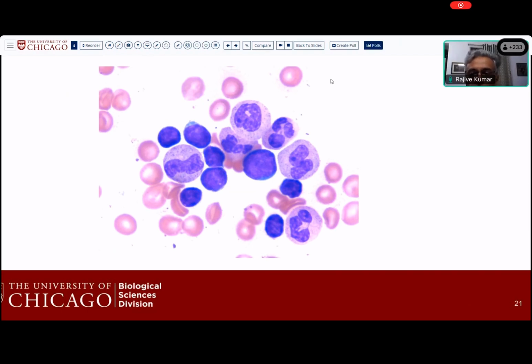After 2 months, the child, who was not on any treatment, celebrated his birthday. There was nothing wrong with the child. So what I'm trying to say is that by noticing this feature of transitioning, without any major change in the chromatin or cytoplasm, there is some change of course, but not very much, that is a good way of getting started with hematogones on morphology. You should learn it well, because in all the places where you don't do morphology, they don't have flow either. So there's no point saying you can't recognize this and you have to have flow. I don't agree with that. Lymphocytes and transitional cells describes the whole scene so beautifully. And mind you, there was no photograph and no description, only these two terms were given. So this is one way of learning.